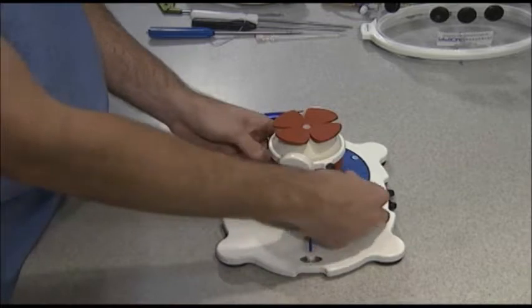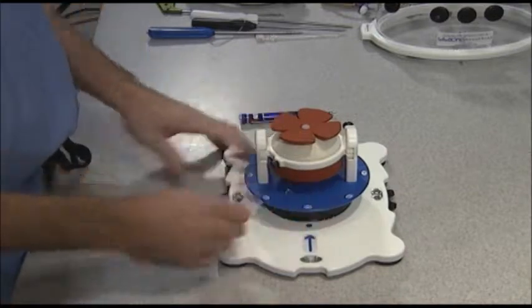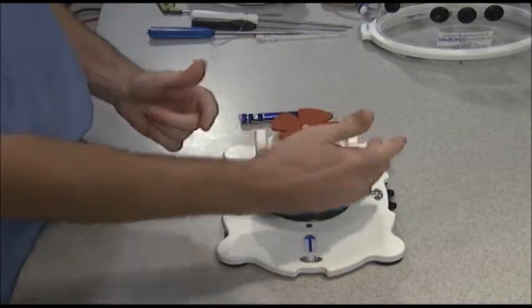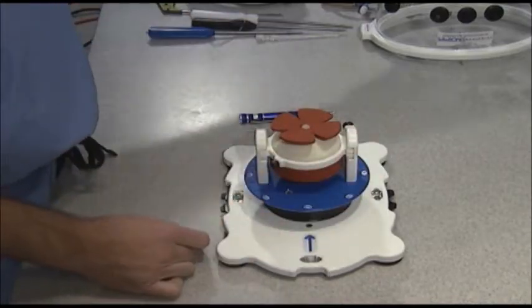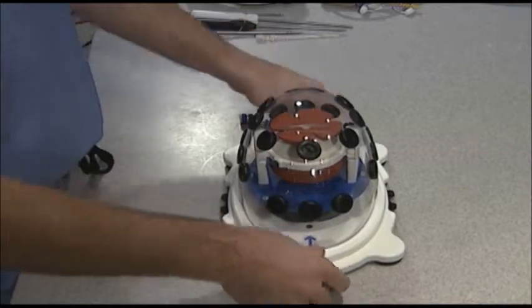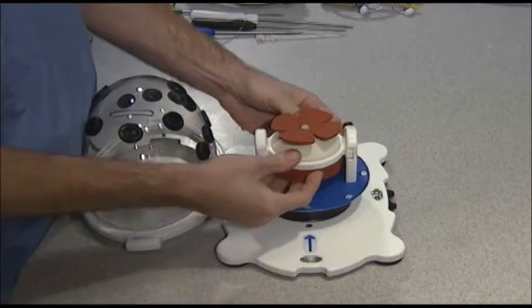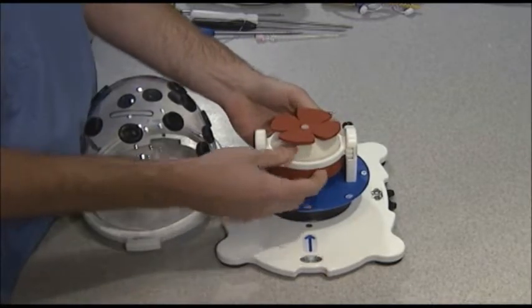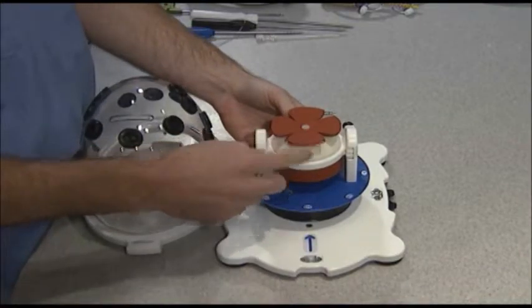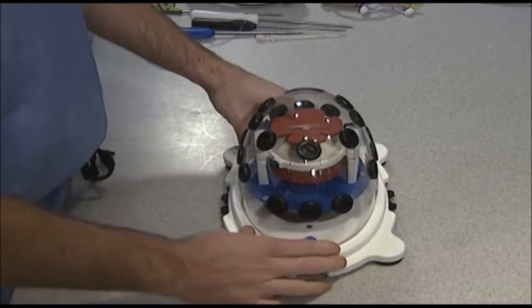So now we'll make that upright, and then we will twist this around, and we're ready to go. The other thing to know when you're doing this module is that you want these two posts to be away from the side that you're potentially going to be working on so that you don't block yourself with the posts. I'm going to put the clear opaque dome into place, and I'm going to twist this so that the leaf of rotator cuff that I'm going to be working with is going to be directly perpendicular to what I'm going to call my lateral working portal.